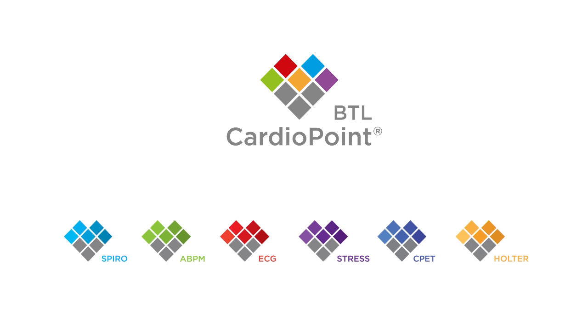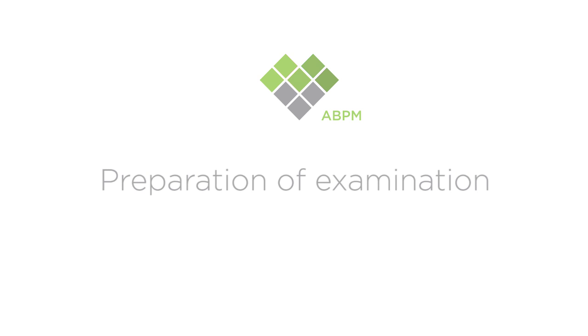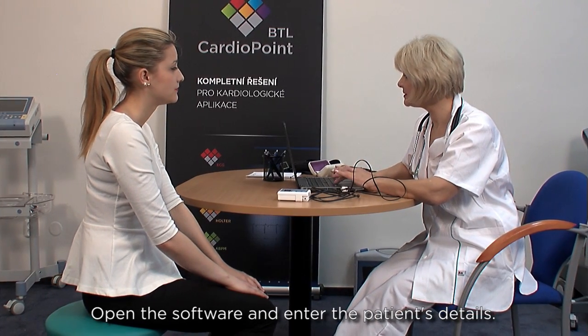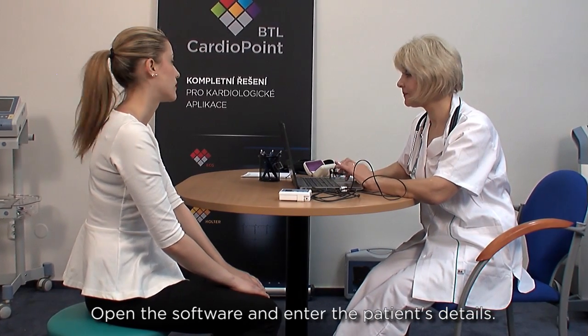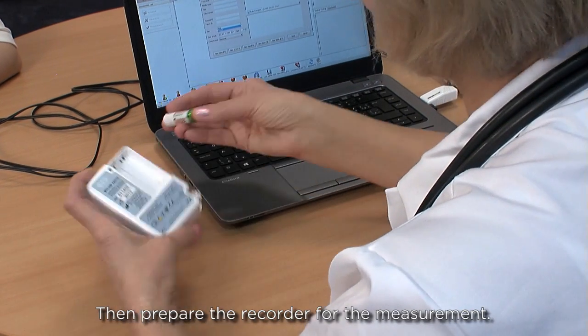This video demonstrates the procedure of ambulatory blood pressure measurement with the BTL CardioPoints system. First, open the software and enter the patient's details. Then prepare the recorder for the measurement.